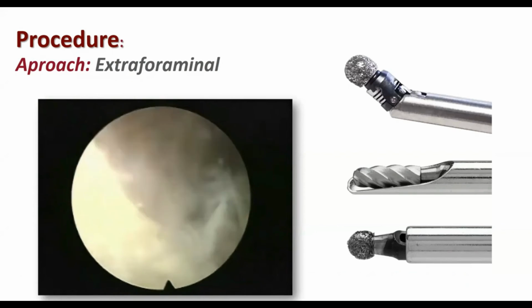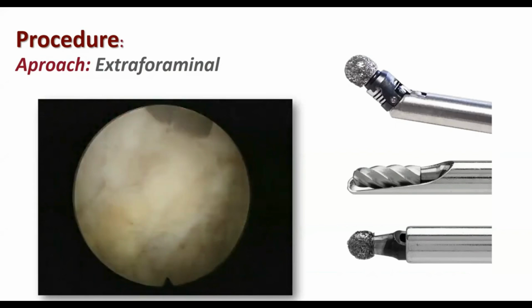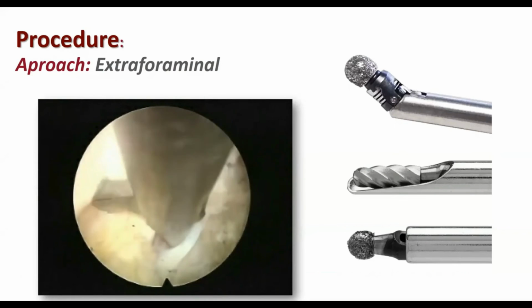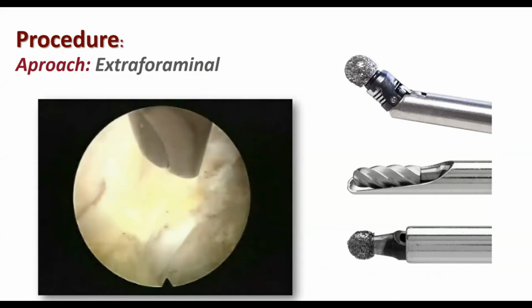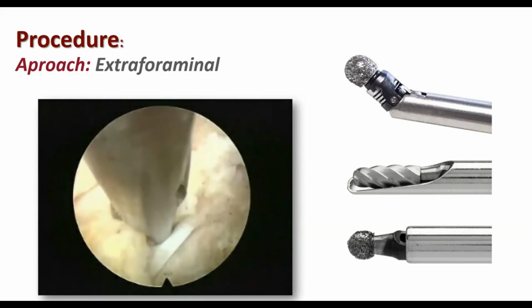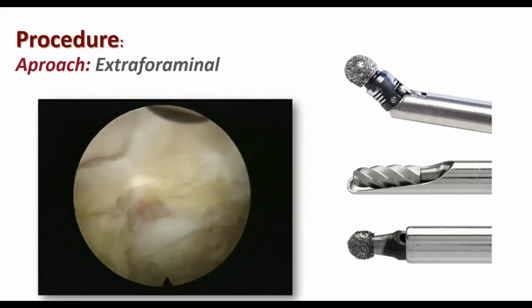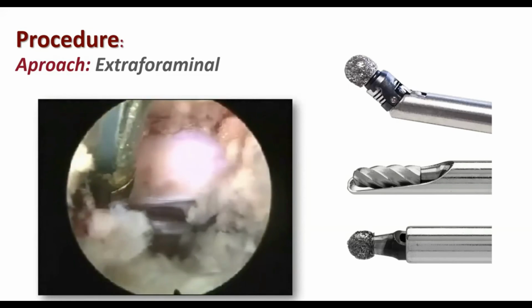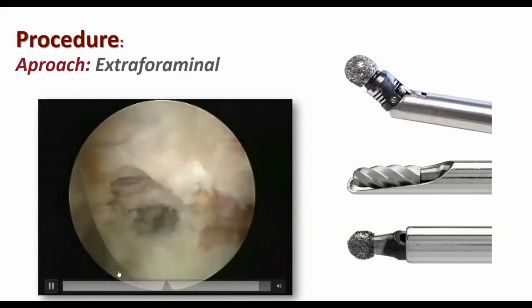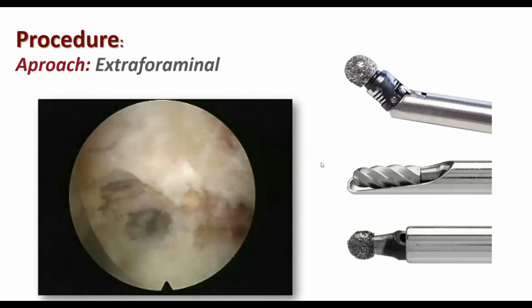Now you see the video from the straight burr, and also we can use, as I said, the diamond dissectable burr. Once you resect the facet part of the SAP, then you can reach the spinal canal better, and then you can do the discectomy, and also you can reach more medially. But this doesn't mean that you can decompress the recess sufficiently with this technique. This is just for discectomy, from my point of view.